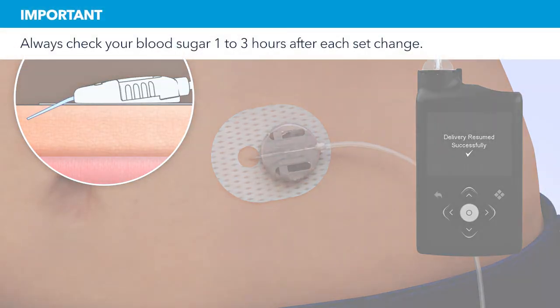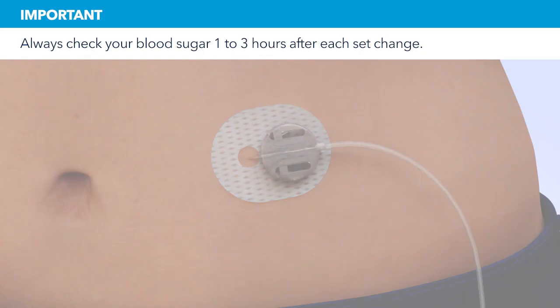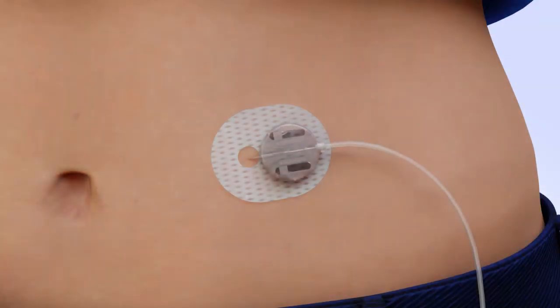Remember, one to three hours after inserting a new set, you should check your blood glucose. Checking your blood glucose is the only way to confirm your infusion set is properly inserted and that you're receiving insulin. Congratulations! You have successfully filled your reservoir and changed your site.